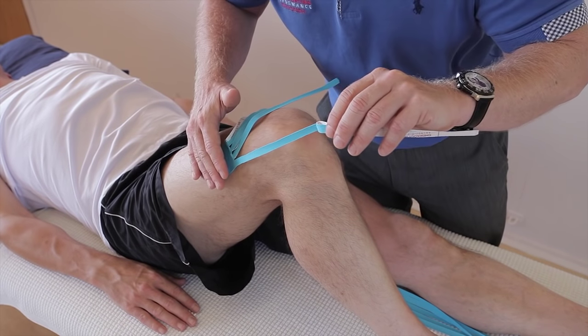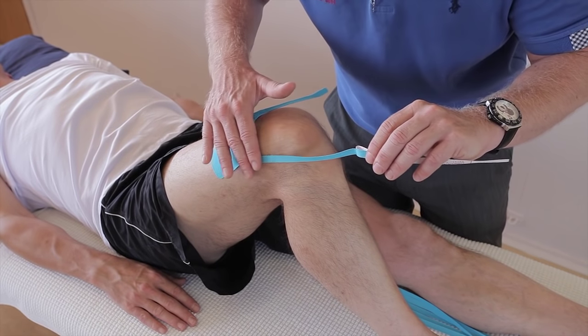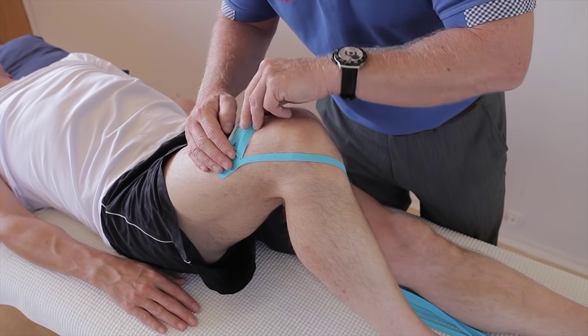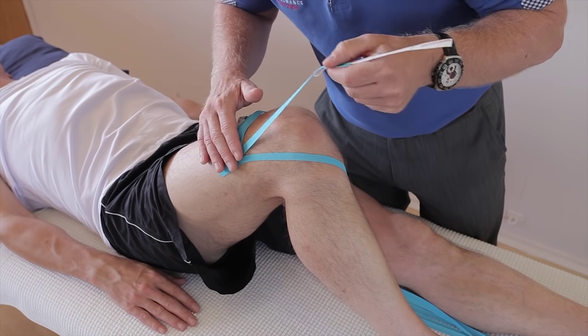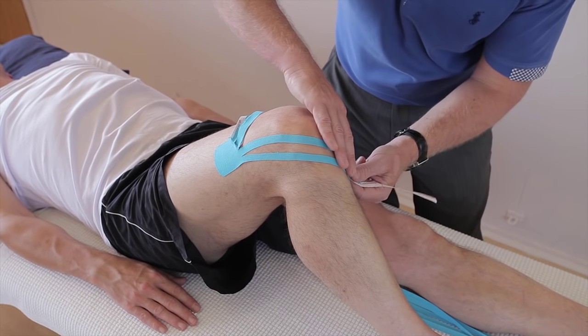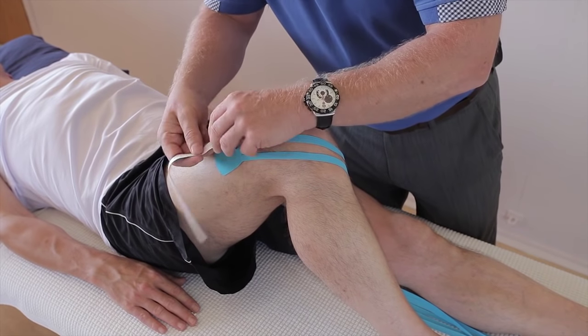It's very tempting to stretch this, but think about where the swelling is all over the knee. This is going to cross the knee like so and just lay it down with hardly any stretch. Pull back the second one — it's a little fiddly, but it's quite satisfying to do this, knowing that it can really help the patient in terms of reducing their swelling.